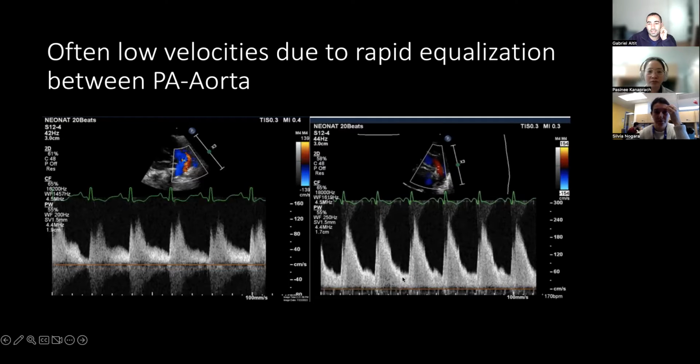And this is similar. You can see that this is very pulsatile. What we're trying to see is that, as the ductus gets narrower and narrower, it becomes what we call more restrictive, which is a very subjective term, because what restrictive means is that it restricts the amount of volume and pressure transmitted to the lungs, right? That's the idea. Or, in the other direction, it restricts the pressure or volume transmitted to the aorta if it was a right to left shunt.